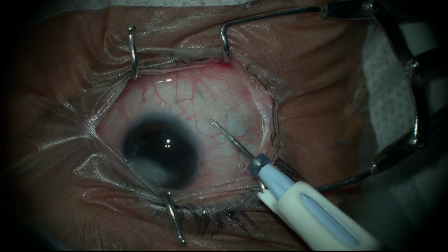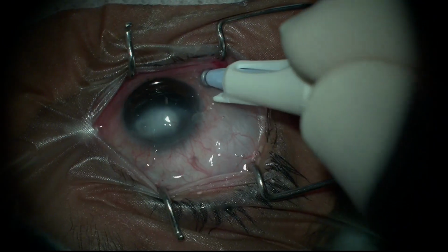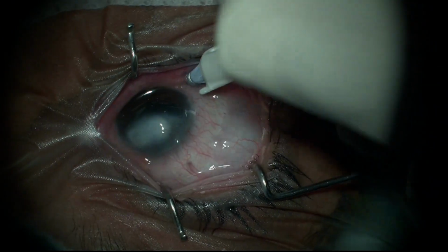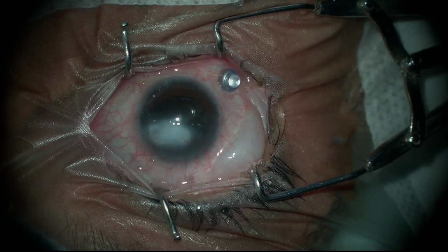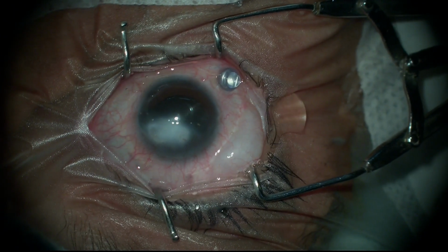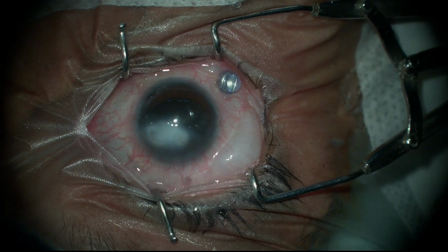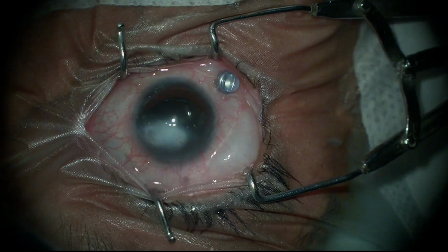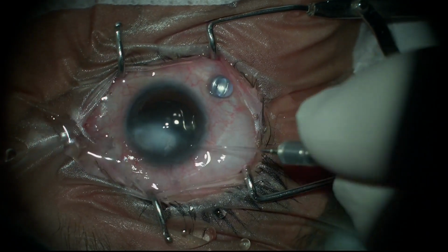Usually this should be the litmus test of the local. If she has pain, that means the local is not that good. But I think she tolerated it well. This is local, which has infiltrated from the inferior part to the superior part.